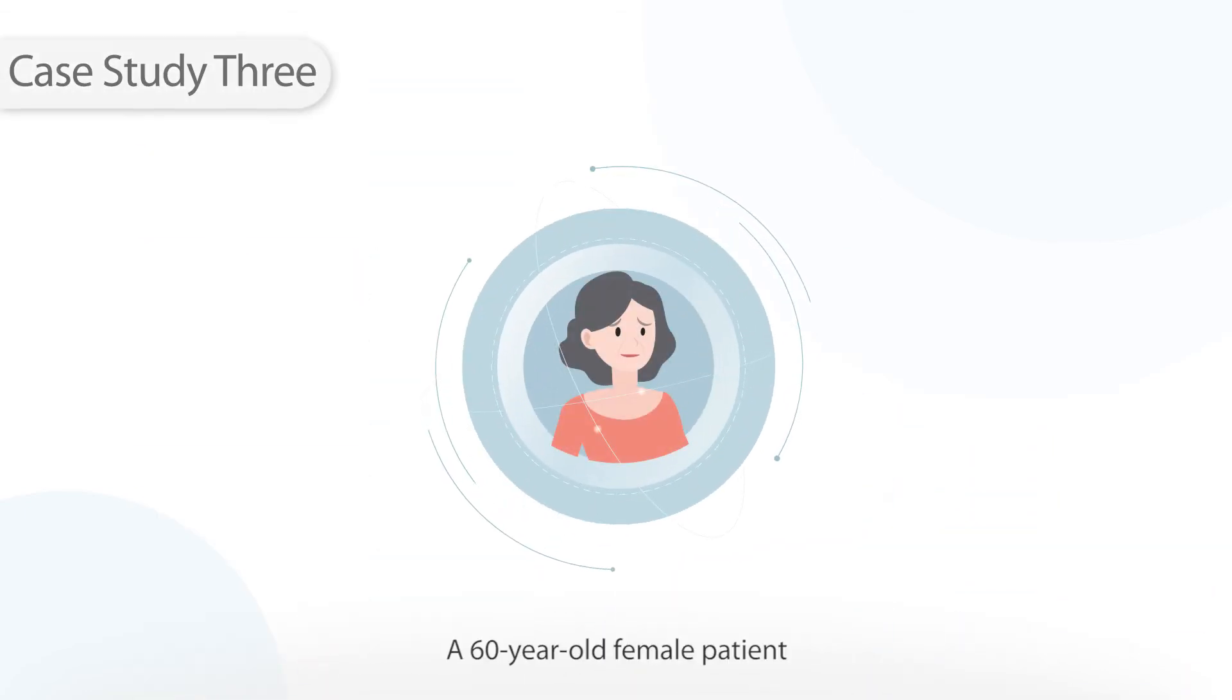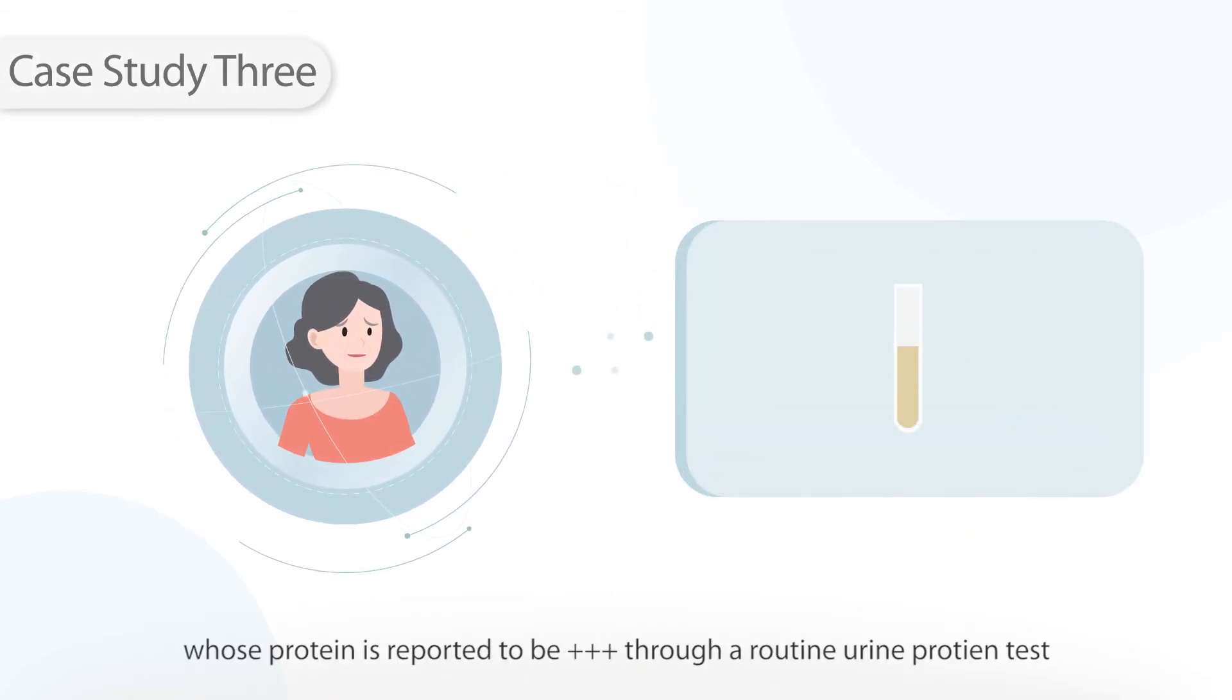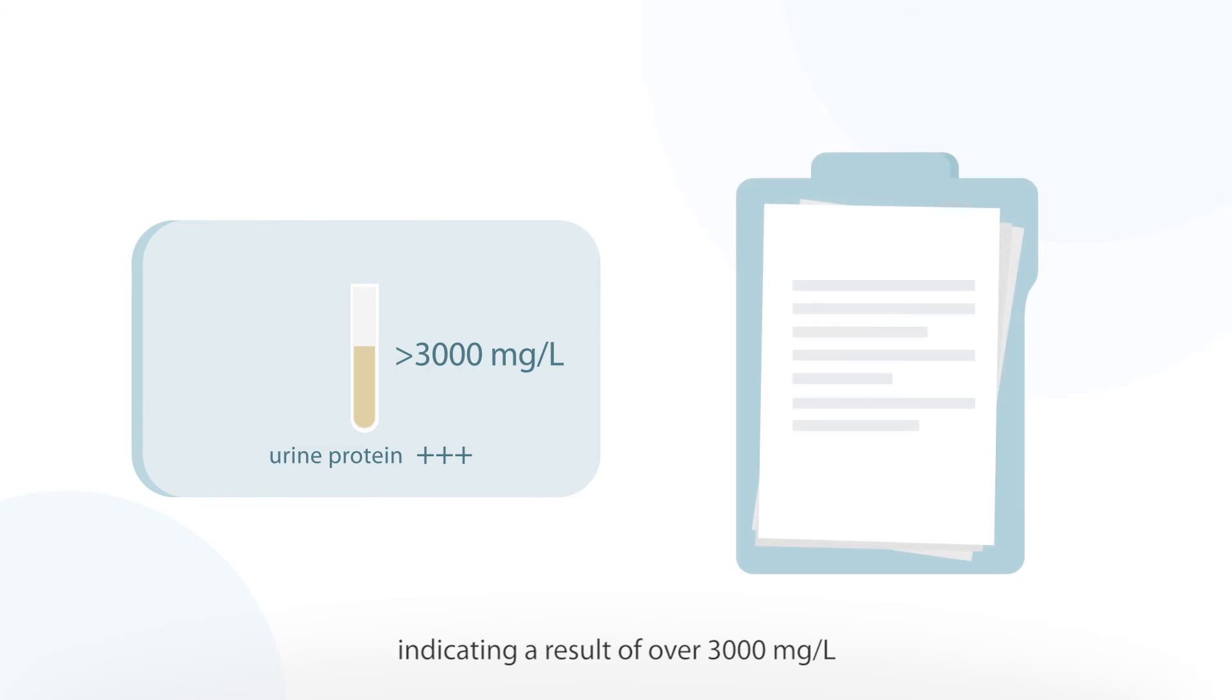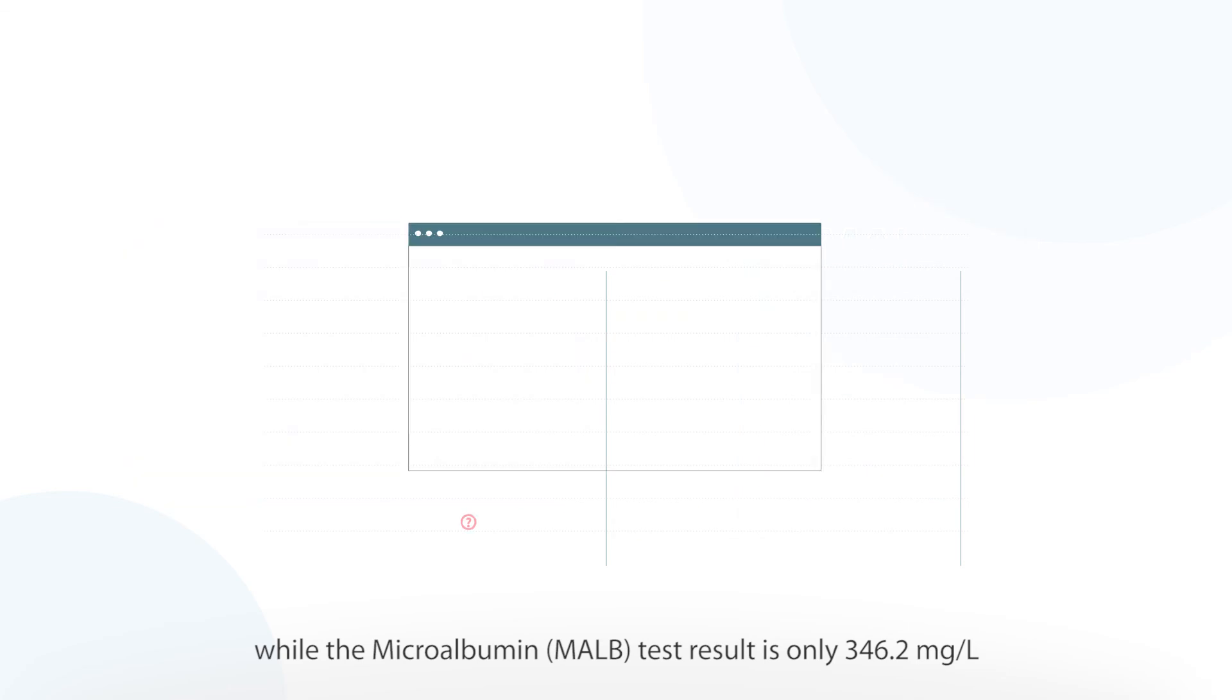Case study 3. A 60 year old female patient whose protein is reported to be triple plus through a routine urine protein test indicating a result of over 3000 mg per liter while the microalbumin test result is only 346.2 mg per liter.